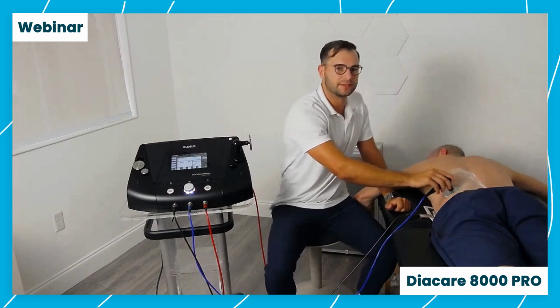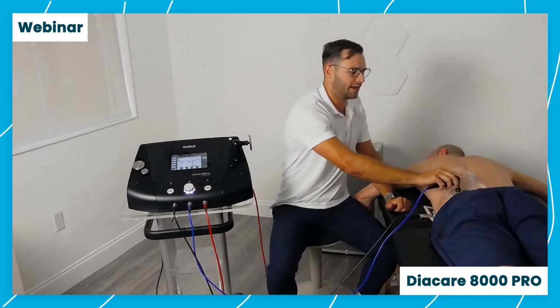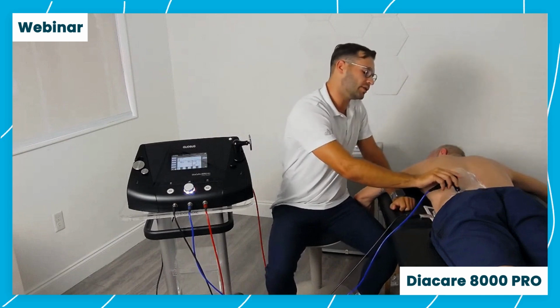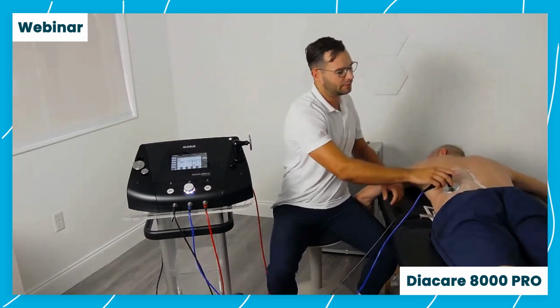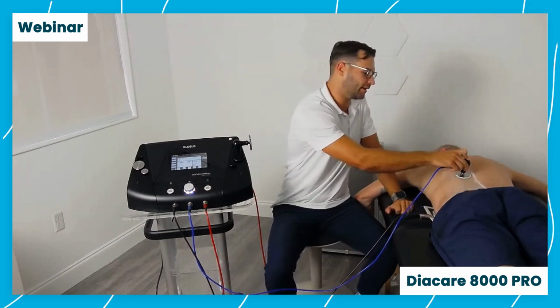We also have the ability to use a hands-free kit. So we can almost use it as if there are sticky pads of electrodes, and it's going to generate the same kind of treatment. However, you can have the patient going through exercises or mobility on their own. You don't have to stand there and treat the patient.